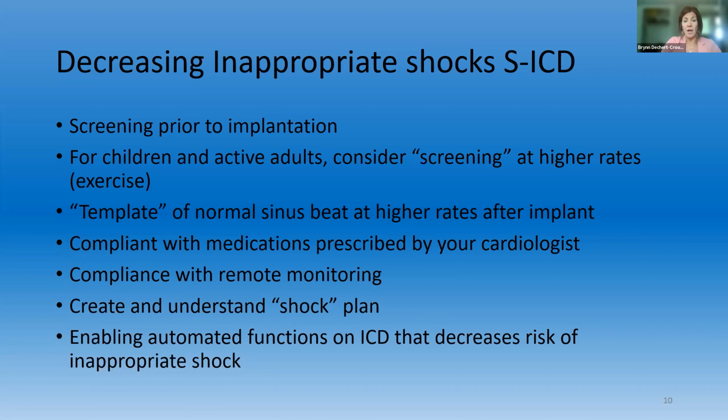Creating and understanding a shock plan. So what to do if you were to get shocked. In our center, we ask the patient to either send a transmission or a transmission comes automatically to us via remote monitoring. This is if everything is fine, the patient has gotten a shock and woke up pretty quickly. And then we want to look at it and see if we can decide if it's appropriate or inappropriate, and then we can make adjustments either to programming or medication.